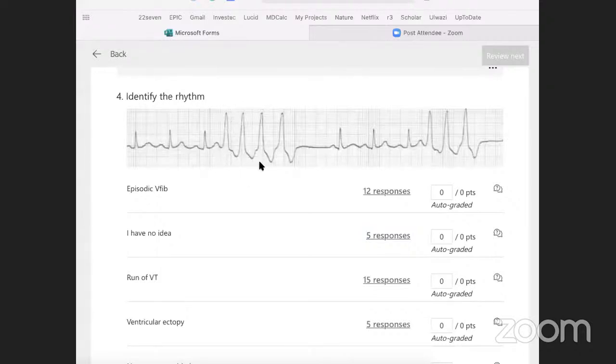So it's one focus that is irritable and firing spontaneously, then self-terminates, then there's a pause as the SA node resumes pacing, and then there's a repeat of that. These are runs of VT, so there would be periodic runs of VT.